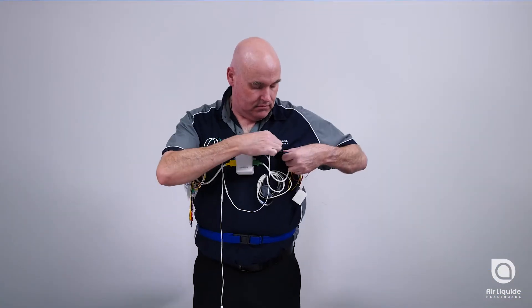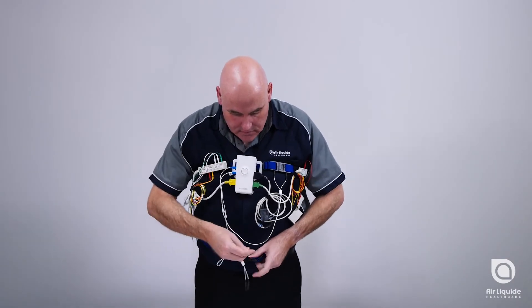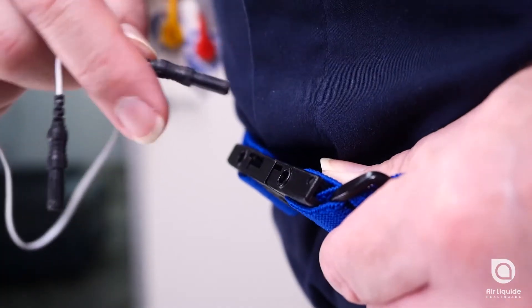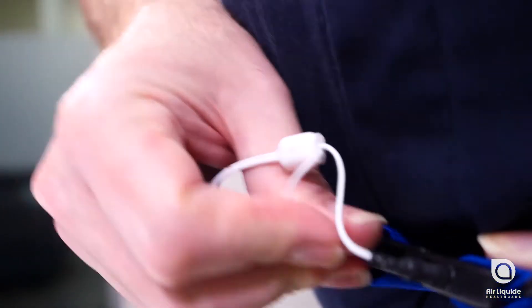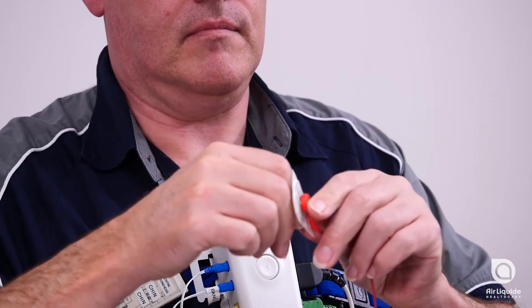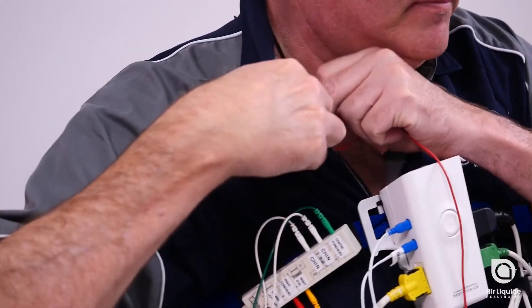Start by plugging the leads into the belts as shown. Peel the back off the electrode tab before applying. Start with the chest sites.